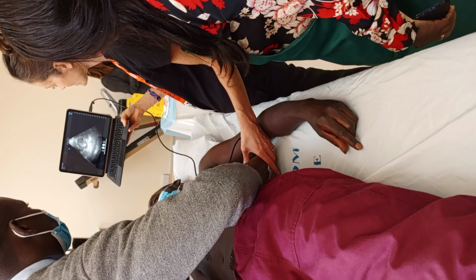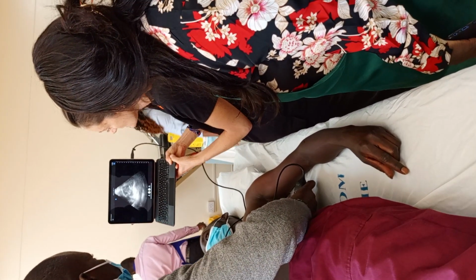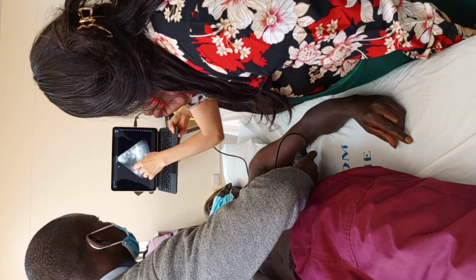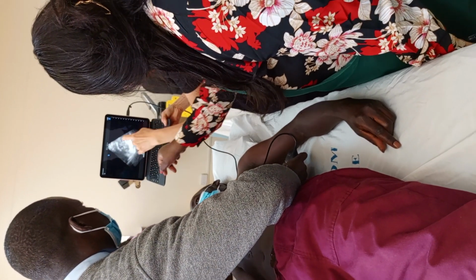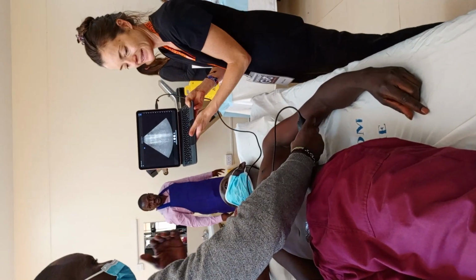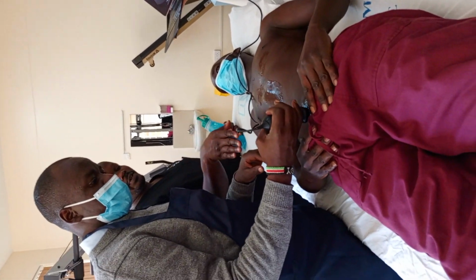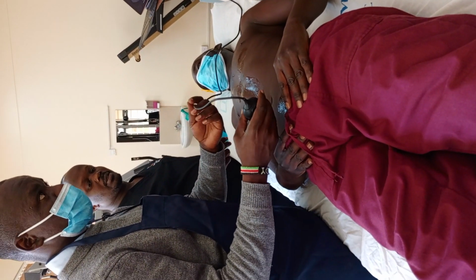There we go. Okay, we're starting. So where is kidney? This is kidney. This is spleen coming into view. This is the spleen right here. This is the kidney. That's the recess. Okay? Lovely, lovely. So you can have it this way or the indicator towards you.